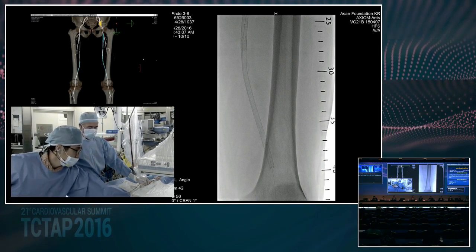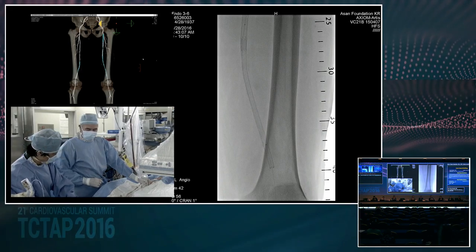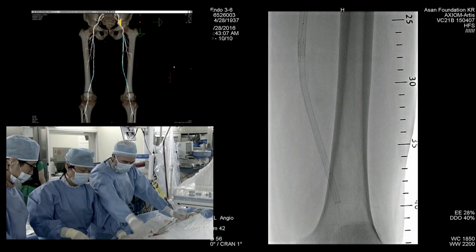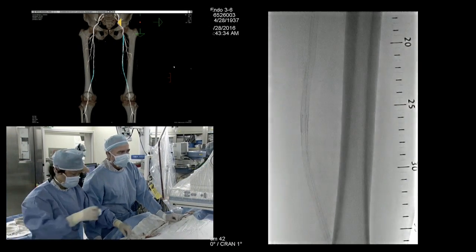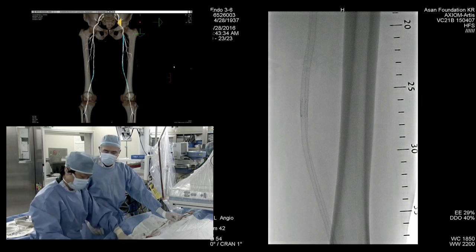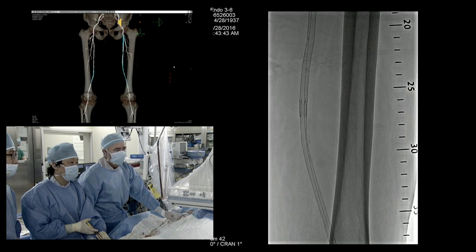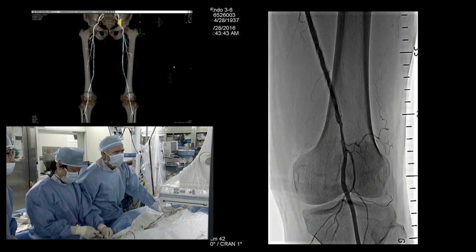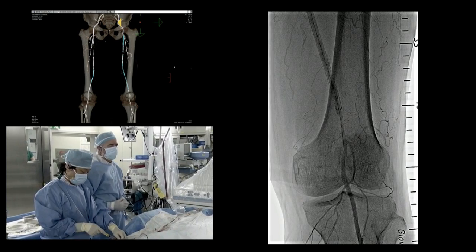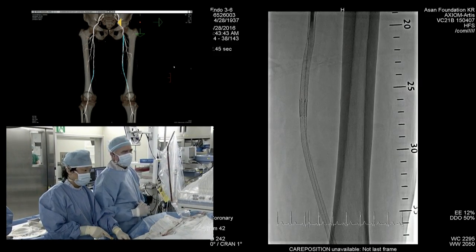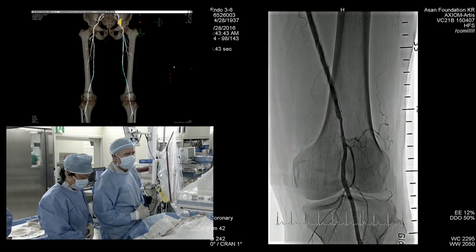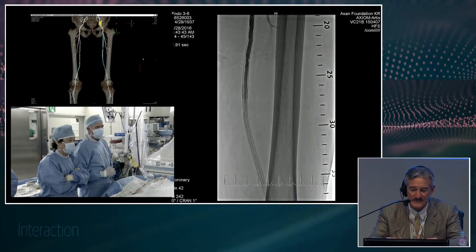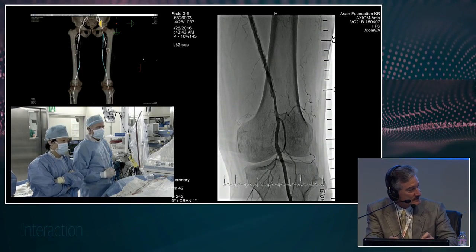We're taking the Savvy balloon out and we'll do a run to see how it looks and decide whether to extend the DCB down below the stent. It looks fairly narrow distal to the stent — I'm thinking we need to treat down to about that branch point with our DCB. It looks about 60-70 percent at least. I would go to the geniculate. Everyone seems to be nodding in agreement, so we have a consensus to treat distally.